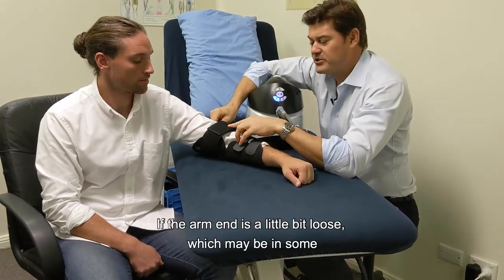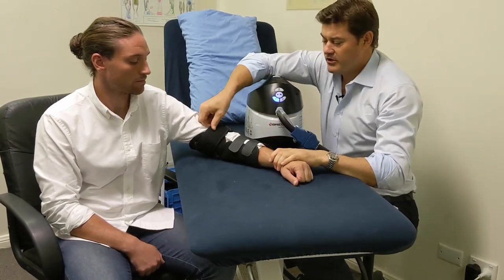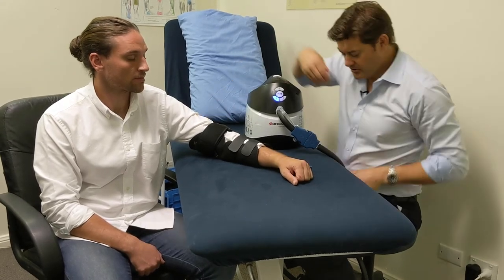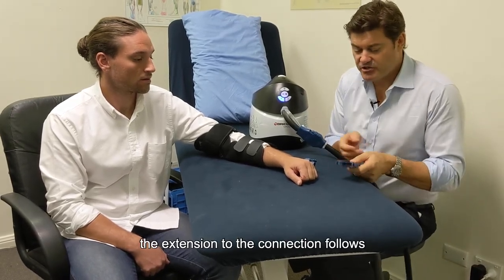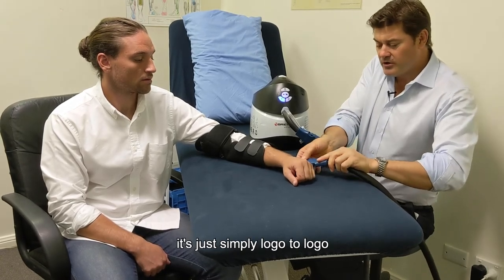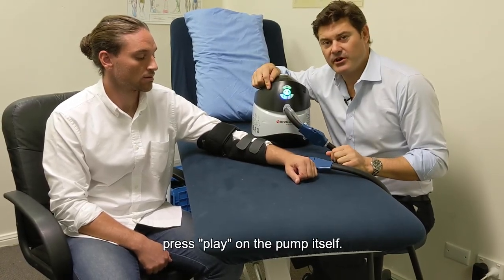If the arm wrap is a little loose, it comes with an extra tensioning section of velcro to ensure a firm fit before beginning. Once the connection is established, attach the extension — logo to logo — and when the patient is comfortable, press play on the pump.